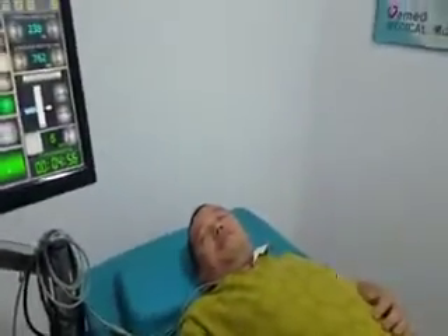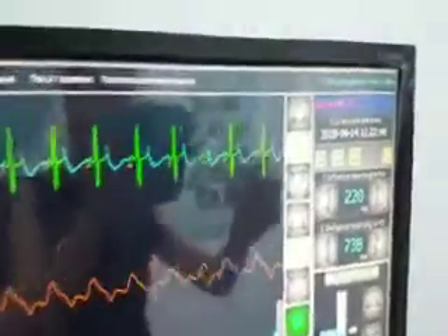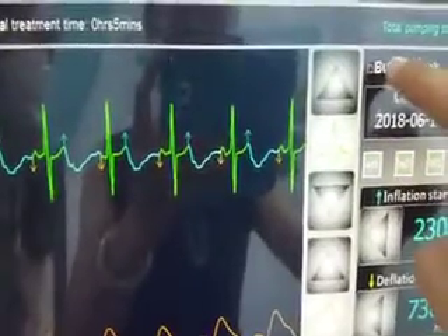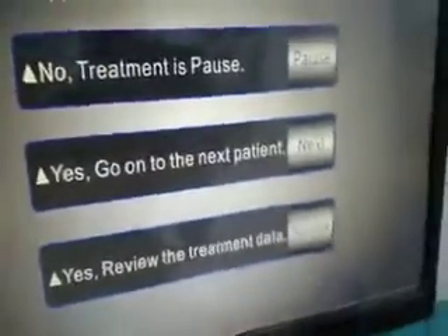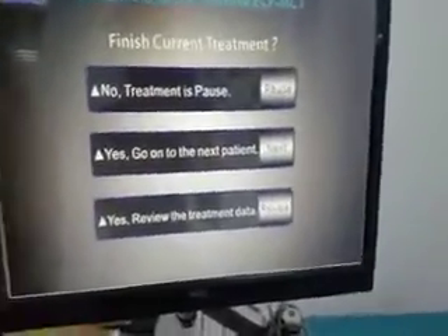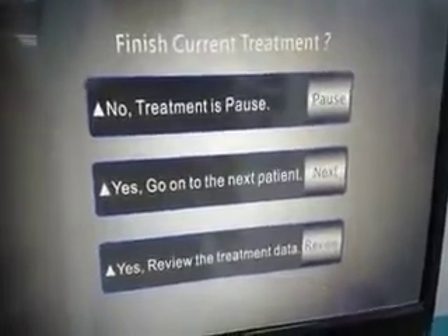Now press pump to start treatment. The machine is running with only 55 seconds shown. You can see that the monitor is locked. We can unlock the monitor display, and we can stop the pump in the middle of treatment — you will hear that there is no pump sound. If the patient needs to go to the toilet mid-treatment, press pump to pause.